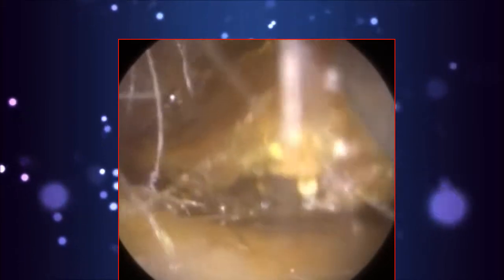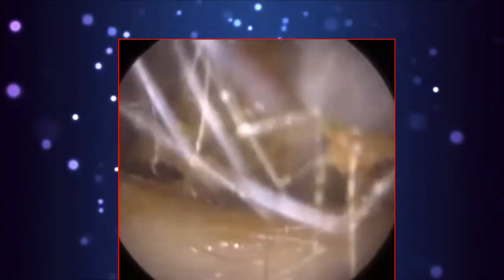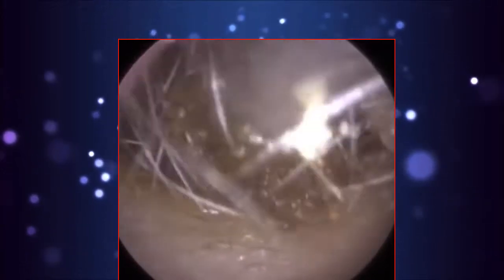had somewhat collapsed, it had fallen upon itself. So the back part of the ear canal, the cartilaginous portion, just at the entrance, possibly due to age, has just drooped over, which has almost concealed the entrance of the ear canal. It's made it a lot narrower and therefore a bit more tricky to remove. That in part could be the reason as to why the patient's developing chronic earwax impaction.